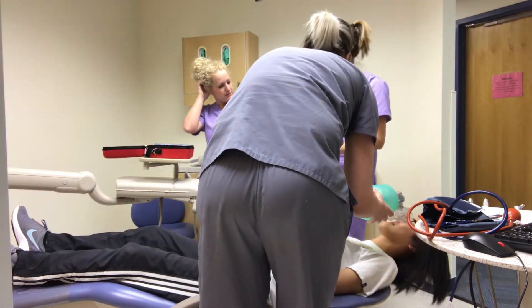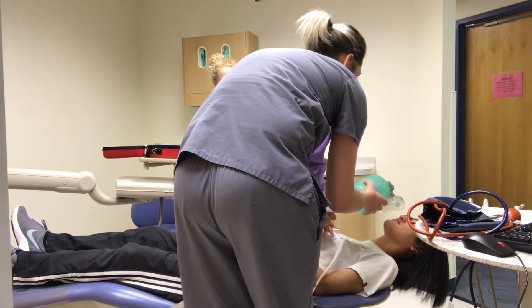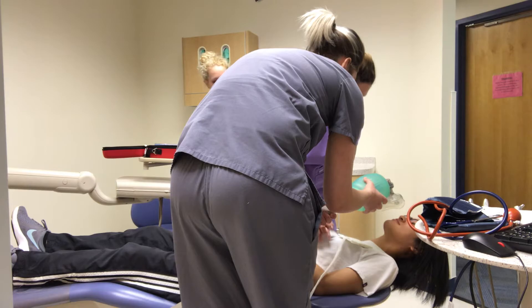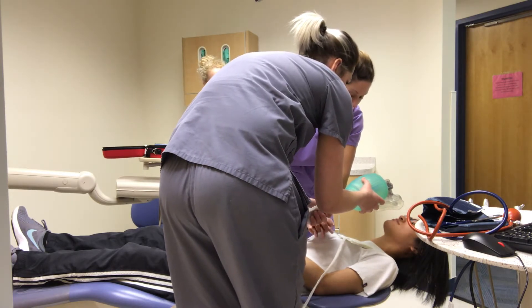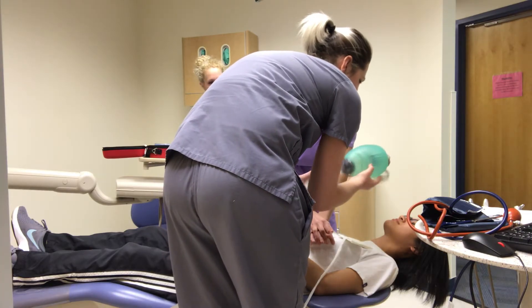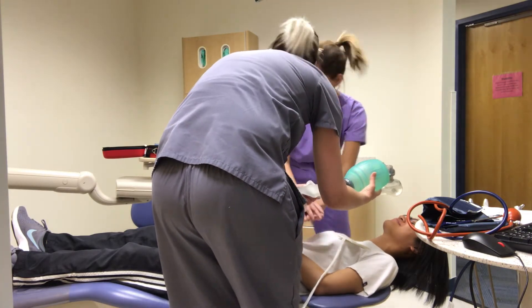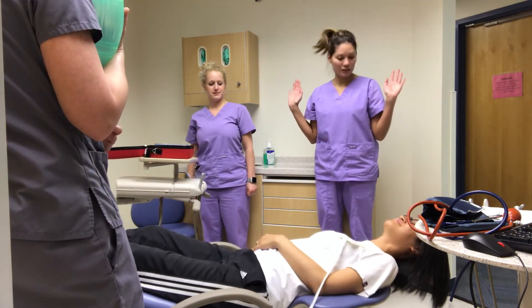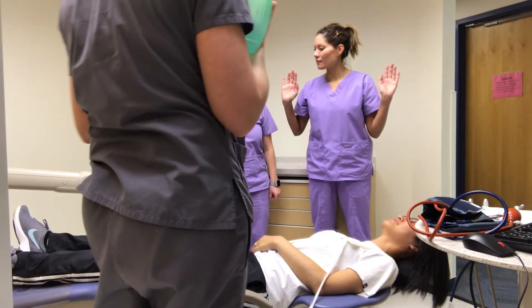Provide chest compressions and rescue breaths. The AED will instruct you to continue CPR for two minutes before it re-analyzes. The AED could say no shock advised, continue CPR. If the casualty shows signs of becoming responsive, place them in the recovery position. Leave the AED attached. Continue to follow the voice and visual prompts that the machine gives you until help arrives.